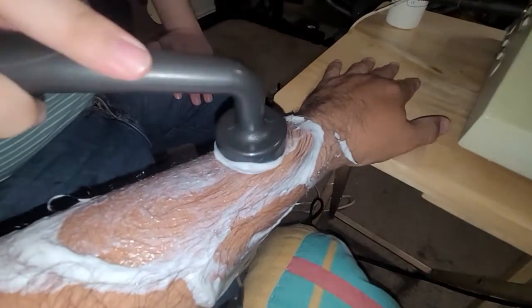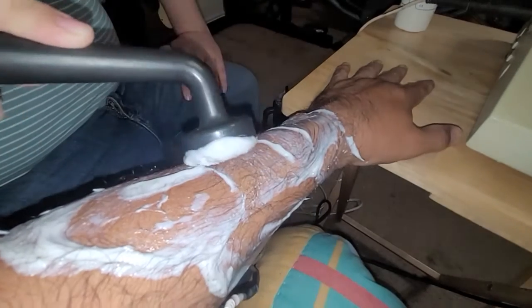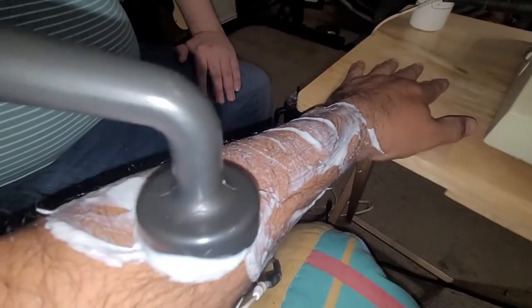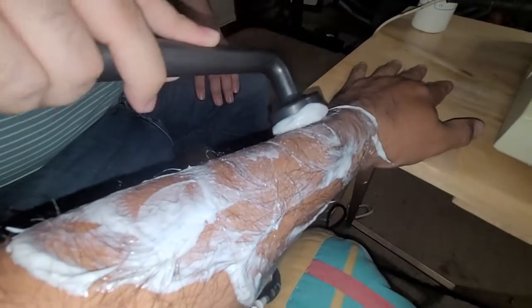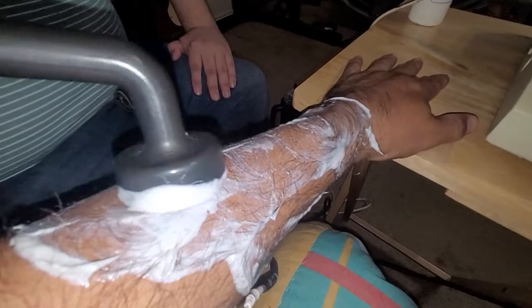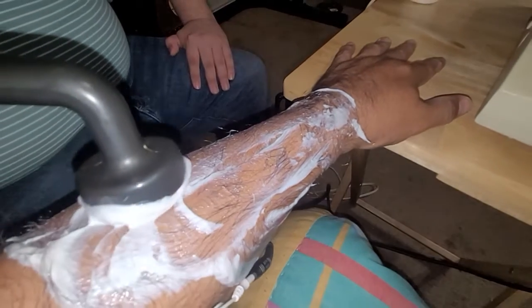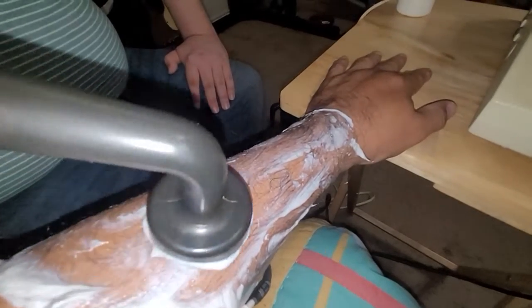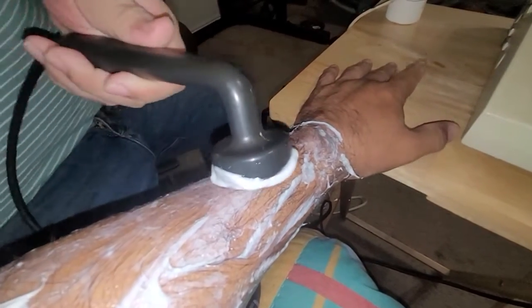And you can work different points along the forearm, trying to get any type of extrinsic muscles that you can get. Sometimes when I'm working with it and he's trying to find a good spot, he's actually very well versed, with your direction and observation, to manipulate the ultrasound E-stim head. Now, of course, no ultrasound is being utilized at this point because, as we set it up, it's at 3 megahertz, 20% at 0.1. So that would almost be considered a sham treatment for research programs. All right.